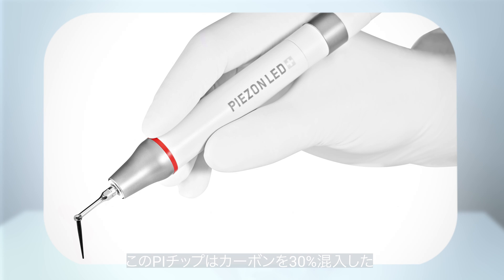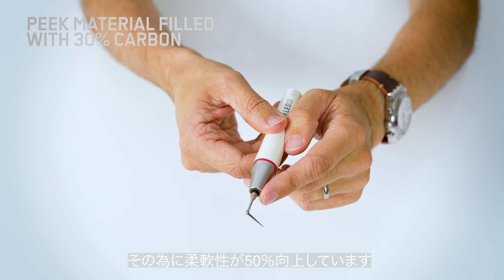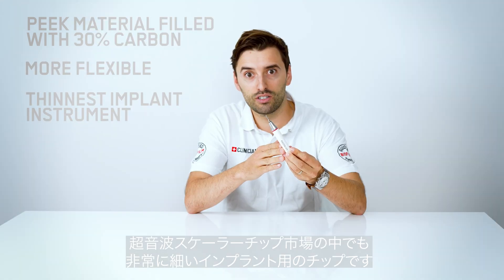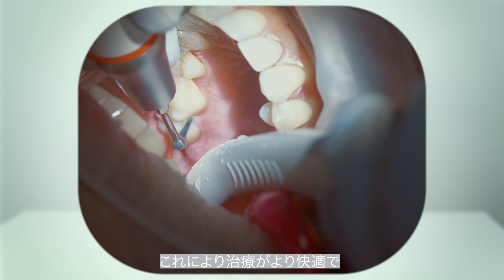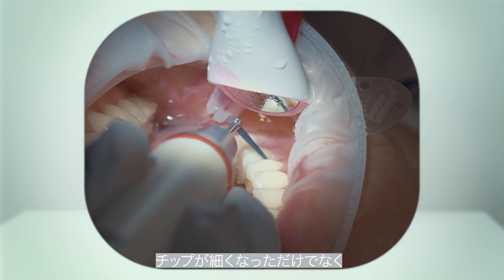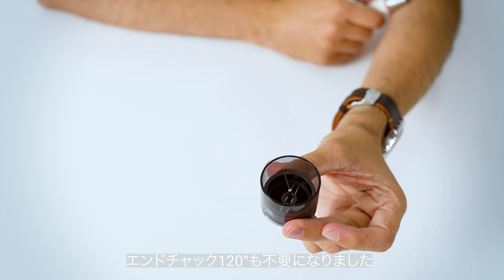This PI is a PEEK material filled with 30% carbon, which makes it 50% more flexible. It is the thinnest implant instrument for power scaling on the market, making treatment even more comfortable for the patient and for the clinician, as well as more efficient. It's as thin as our PS instrument, and the good thing is you don't need the EndoChuck anymore because we can use the combi torque and apply it directly on the handpiece.